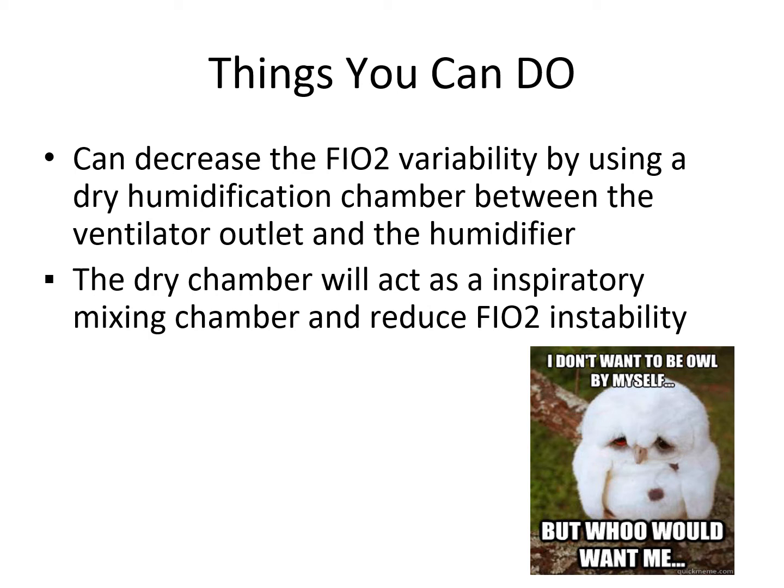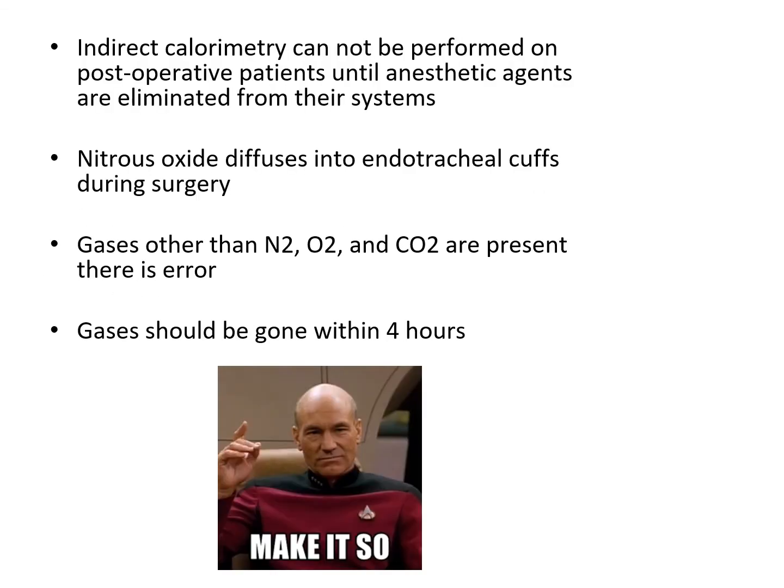They recommend that you use a dry humidification chamber between the vent outlet and the humidifier. The dry chamber will act as an inspiratory mixing chamber and actually reduce your FiO2 instability. So if you can do this dry, because the water is going to lead to errors.